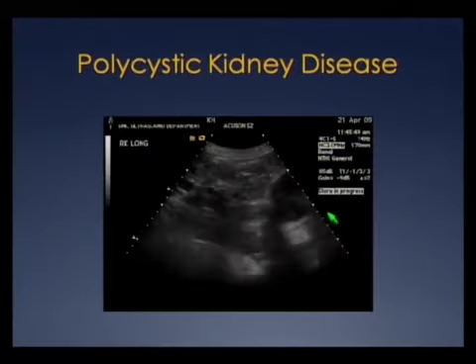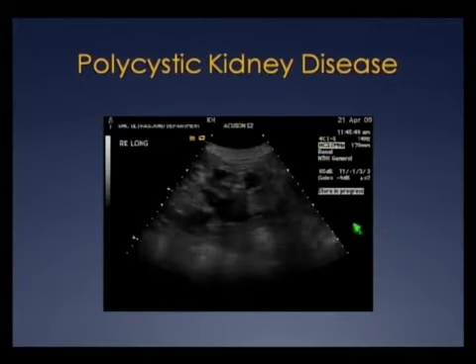I'm sorry, I said liver, I meant kidney. And the kidney was actually enlarged. It was about 16 centimeters.